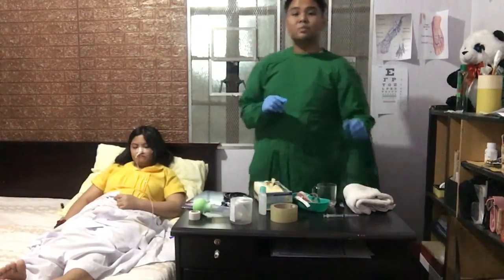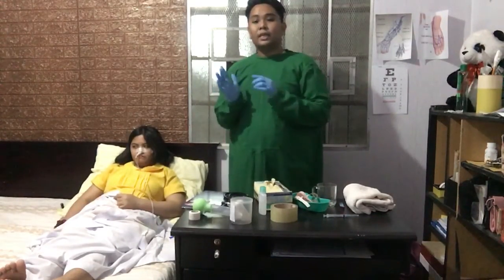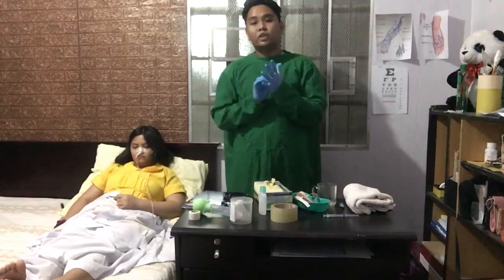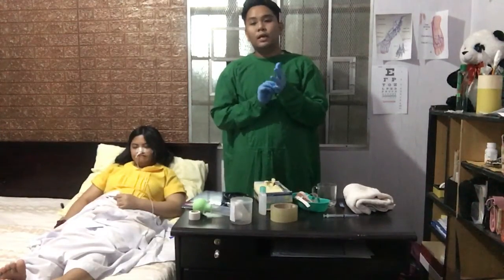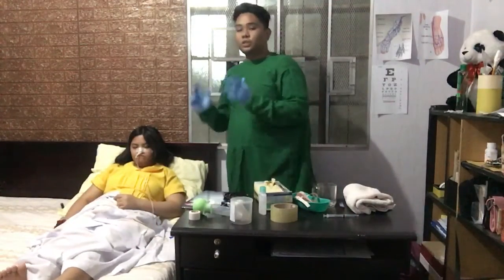Then, if it is not possible to aspirate contents, or the assessment to check placement of the tube is inconclusive, or the exposed tube length has changed, or if there is any other indication, we may use an x-ray to identify the position of our NGT.